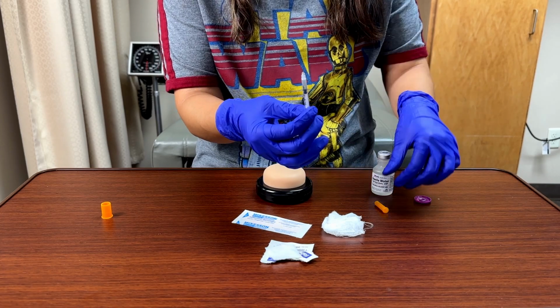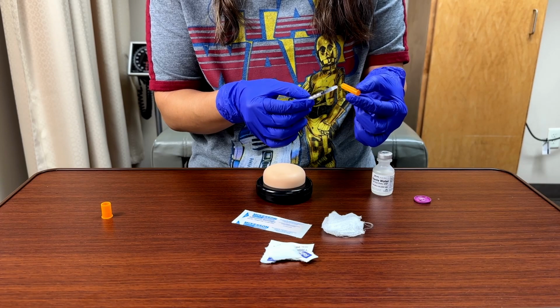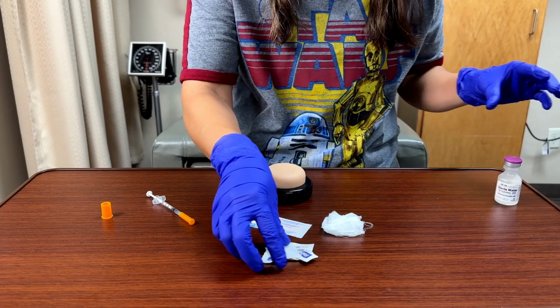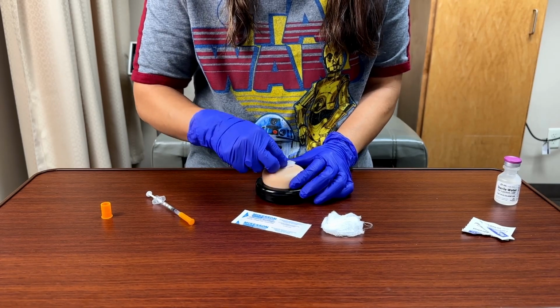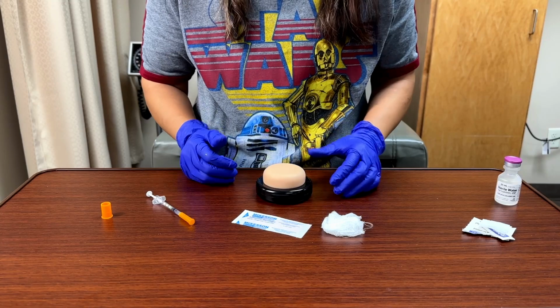Okay, so once I have my medication in here, if I need to prep the skin, I can place the cap back on gently. Okay, I'm going to set this aside. I'm going to set my medication aside. Now, I only have one of these. I'm going to use the same one. You should have a separate one to use. But on this one, I'm going to clean the skin. Okay, I'm going to let that dry without fanning it, without blowing on it.